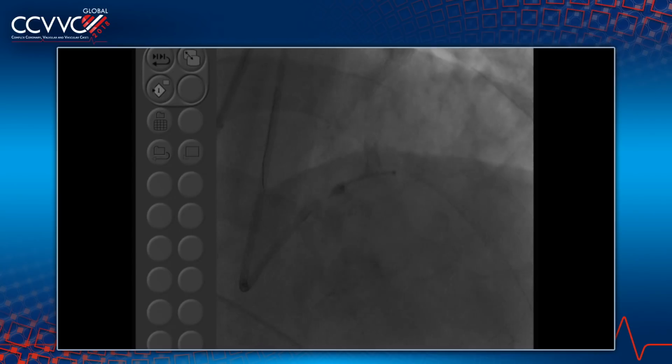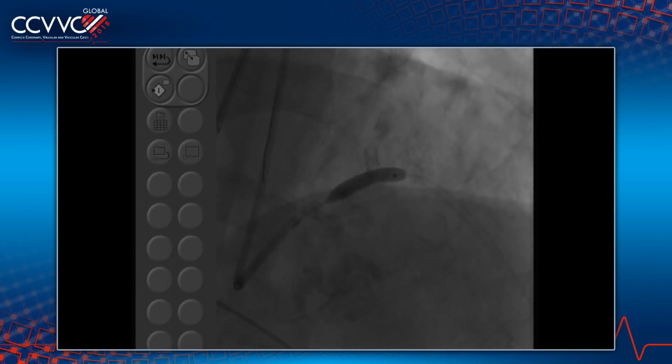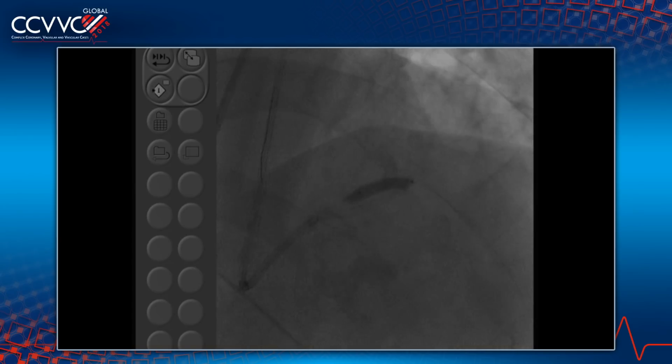Okay, good. And then you dilate the main vessel now. That's what's happening. Are you still doing much SKS? You were popularizing that a few years ago. No, not much, only in an acute emergency situation. We learned that on the long run. Go quickly, one more inflation. So, Samin, did you come back? No, okay, I guess it's good.